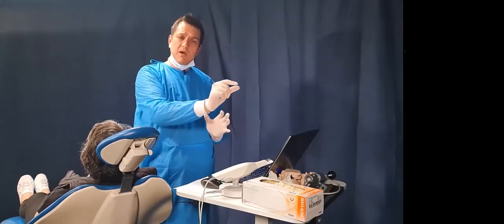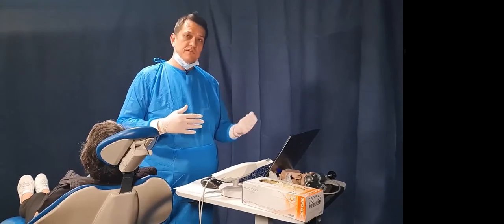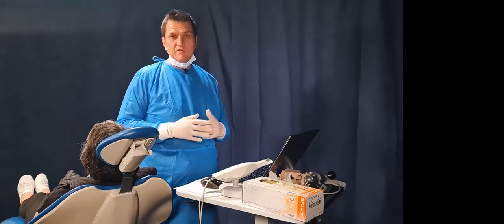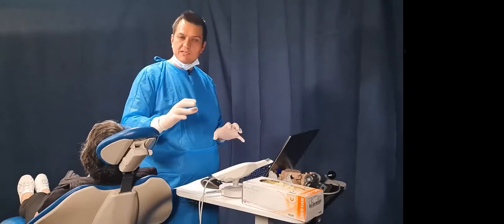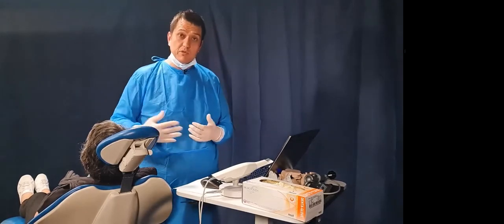I will start by running around where the occlusal surface would have been, and then I'll start to fill in the gaps. And the last thing I'll come back to, I do actually like to go down into the hamular notches in the first pass, particularly in quadrant 2. You'll see from our screen as well, so we'll cut to screen, cut to hand, cut to screen, cut to hand, and we'll get Mr. Cameraman to pull in for us as well.